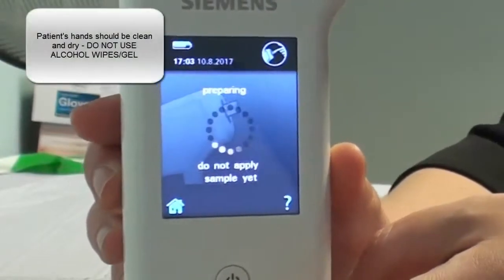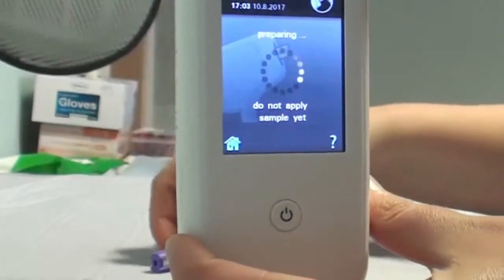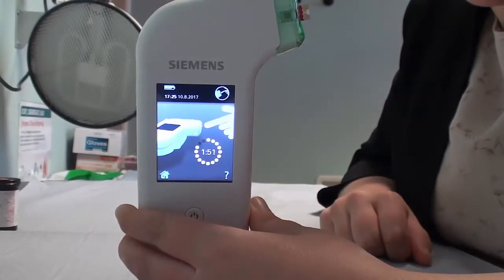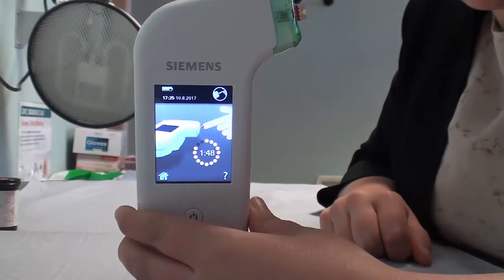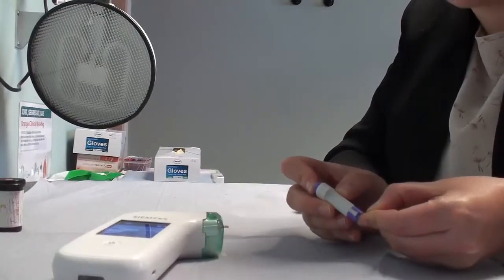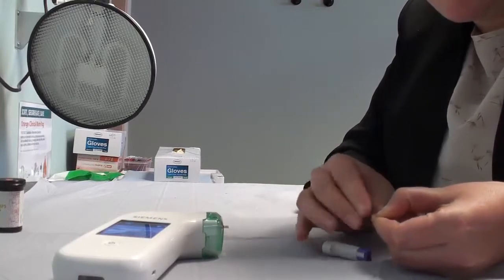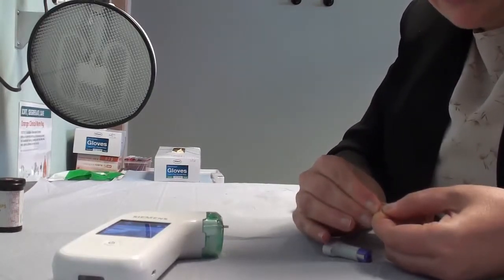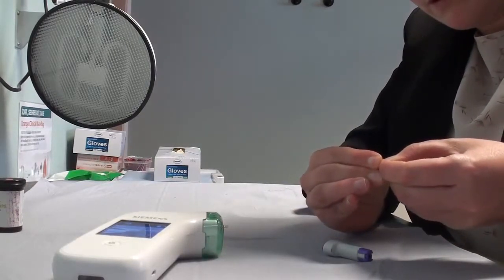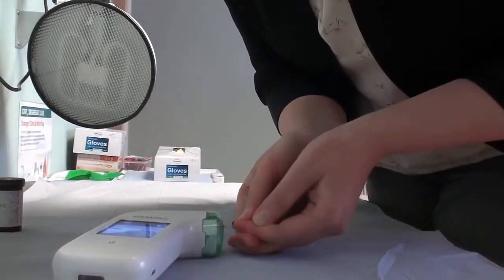At this point you can be starting to get the patient ready for the finger prick, and I have my lancet prepared here. You've now got two minutes to apply a ladybird-size bleb of blood to the tip of the strip right here. Prick the patient's finger with the lancet, prepare the bleb of blood by putting pressure around the bleb, and then apply the bleb of blood to the strip.